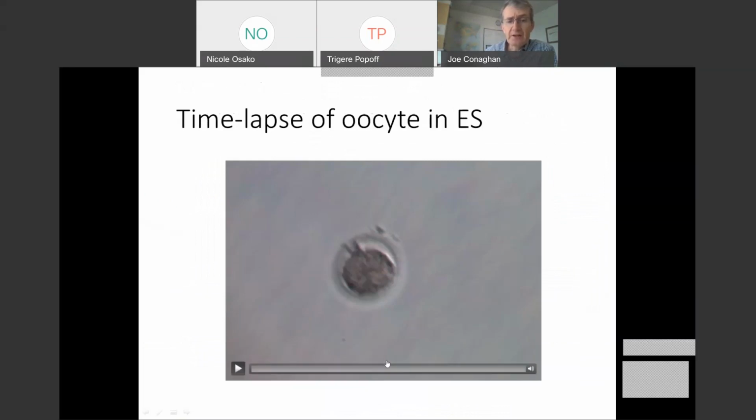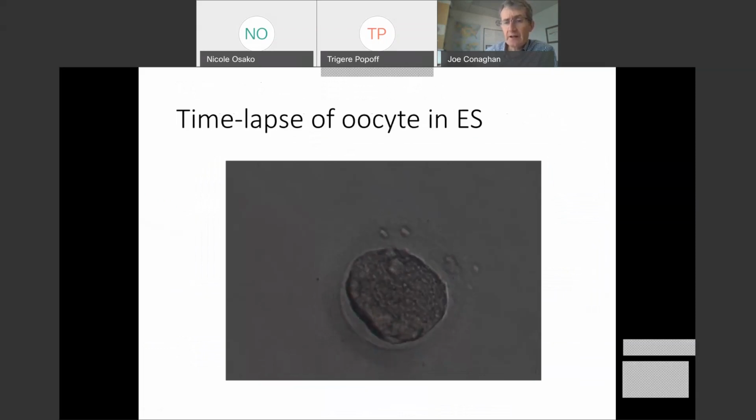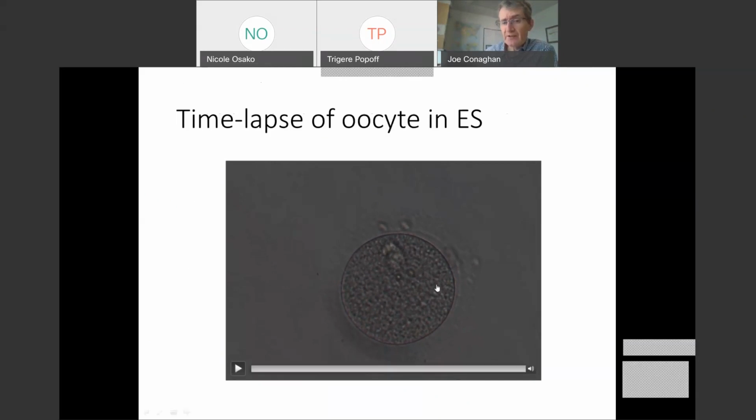Now, I have a little video right here. This is a time-lapse video of an oocyte in the equilibration solution. And the water has already instantly left this cell, but you can see now, as this is a sped up video, time-lapse, that the egg is coming back to its normal size. And this little video is just 20 seconds. But what we're looking at here took 10 minutes, it was a 10-minute filming, but because it's time-lapse, it's only 20 seconds. So essentially every 2 seconds that you're seeing on the video represents 1 minute in real time. So you can see that the egg has come back to normal size.